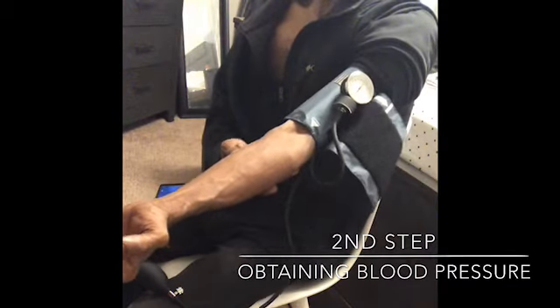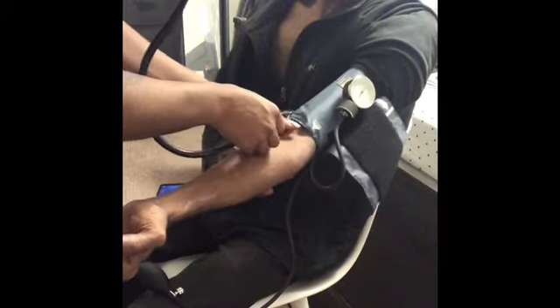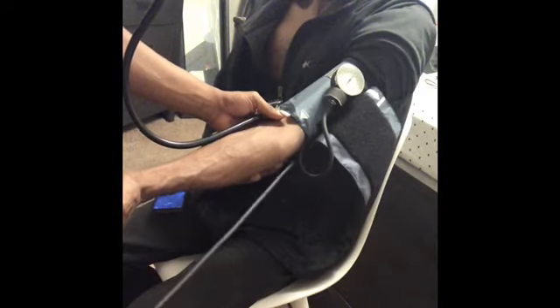You're going to make sure your stethoscope is right so you can hear. The ears need to be facing forward. You're going to put the bell on the artery and you're going to pump up your blood pressure cuff 30 millimeters of mercury past the occluding point.